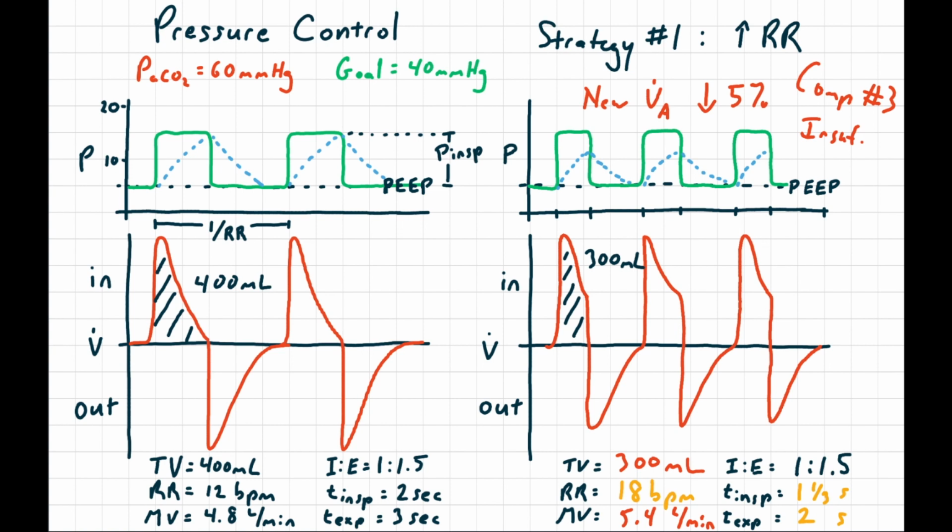Unlike auto-PEEP, this isn't directly harmful to the patient. It doesn't build up pressure or disturb subsequent breaths. You don't need to reach zero flow on inspiration the same way you do with expiration. But if you don't reach zero flow on inspiration, any further increase in respiratory rate is going to decrease tidal volume in pressure control mode.